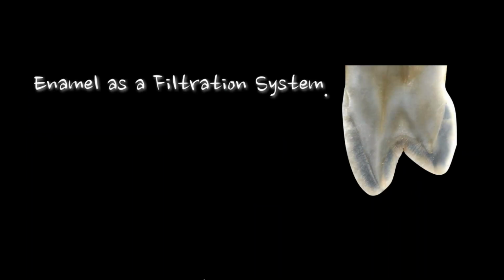So for me, opacity on the inside, again, options: margin materials, liner materials, flow dentins, opaque dentins, any of them work well. Just your concept of where to put them becomes king. As far as what Jim said I was going to talk about, which was the enamel system, I'm going to simplify that by saying if you really understand the internal, then all the enamel is doing for you is either filtering the light or allowing all the light to go through.